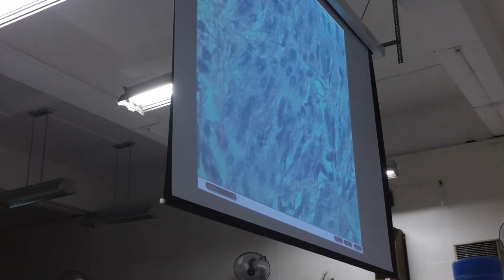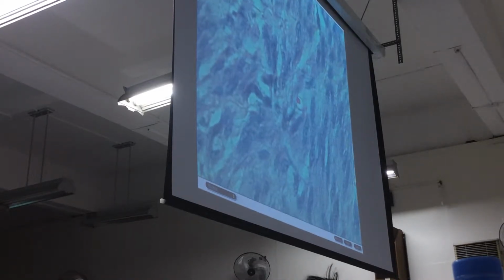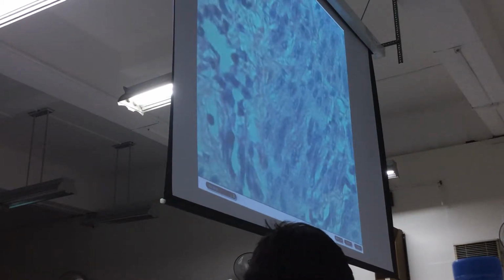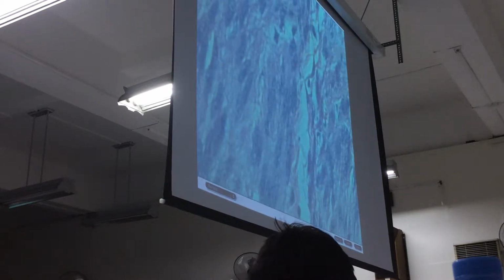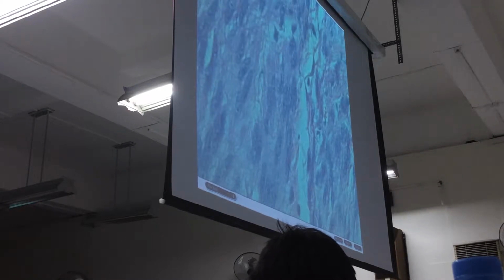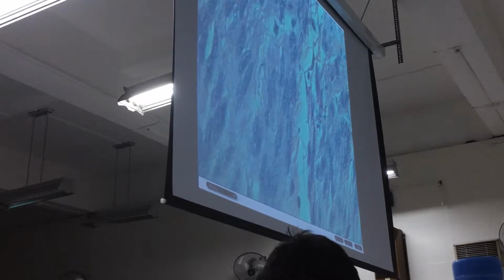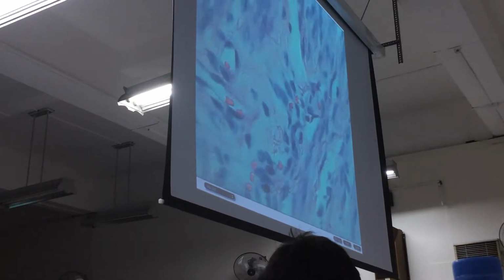So during pregnancy, if you have a corpus luteum of pregnancy in the ovary, you will have decidualization of the endometrium, and in the myometrium, such as seen in slide number M1001, you will see enlargement of the cells and numerous cells comprising the myometrium itself.